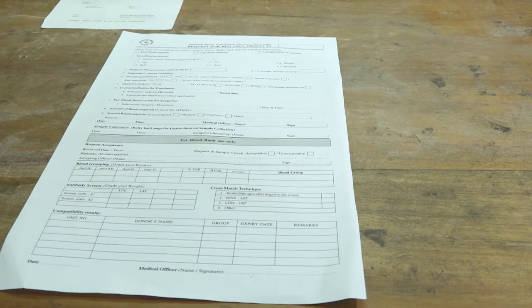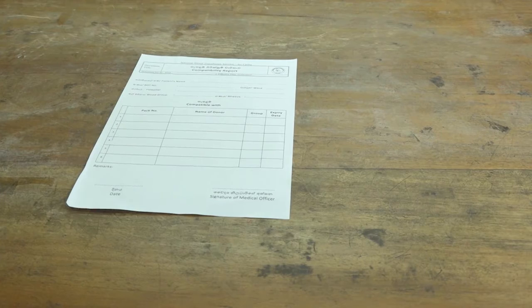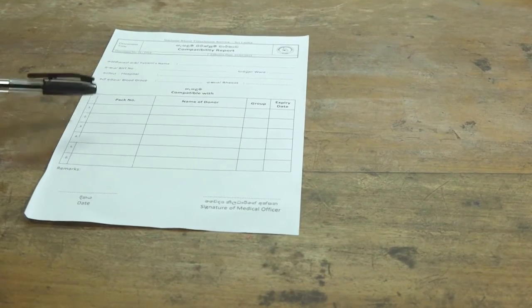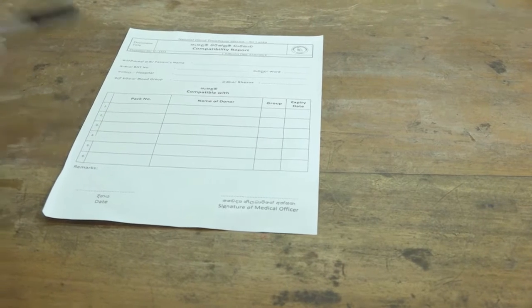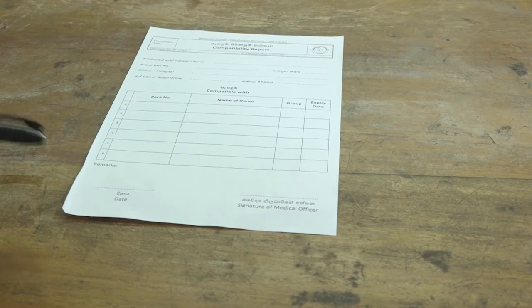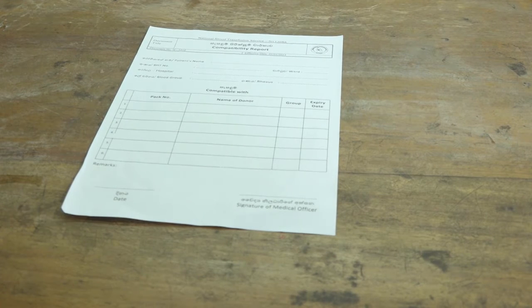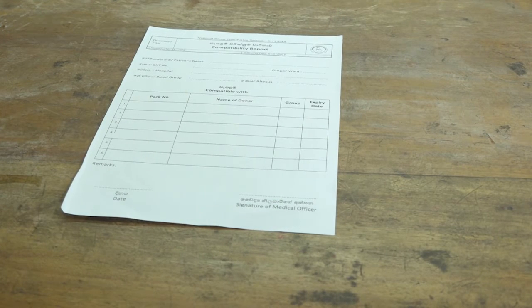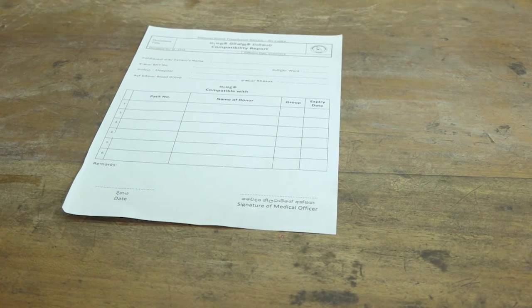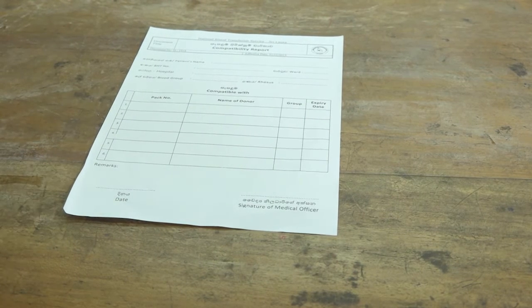red cells, and they will send you a compatibility report such as this, mentioning the patient details and the donor packs which are compatible with your patient. This will be fixed to your patient's BHT, and when you need the blood, you have to send the compatibility report back to the blood bank, and they will release the relevant blood pack.